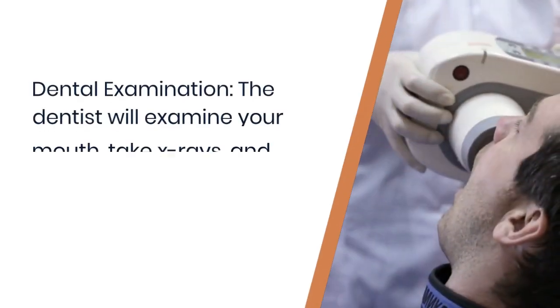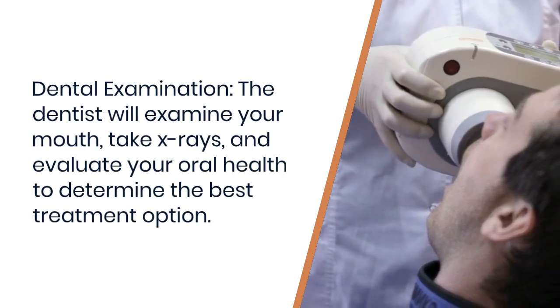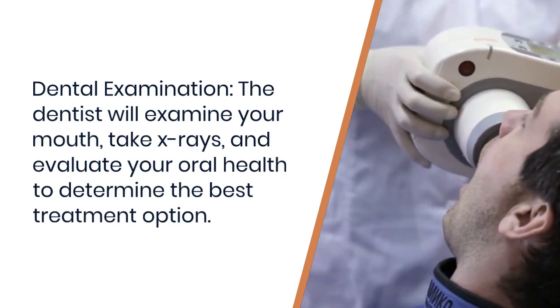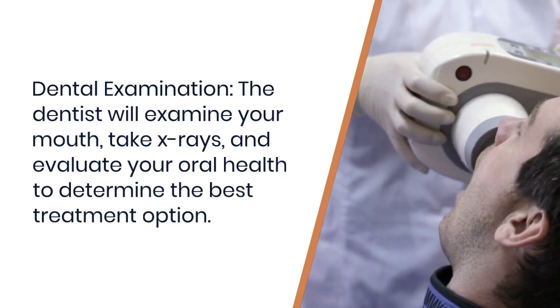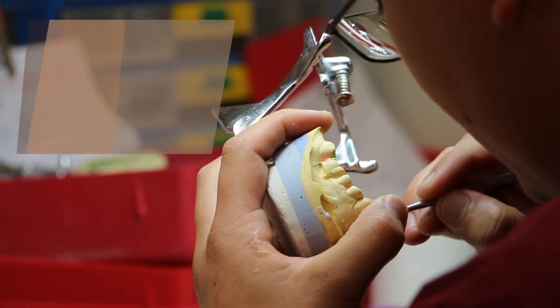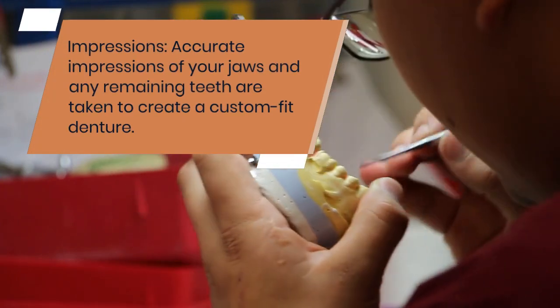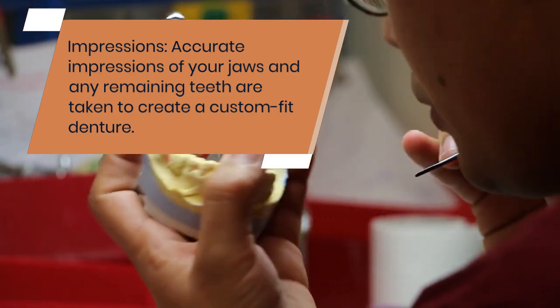The process of getting dentures typically involves several steps. Dental examination: the dentist will examine your mouth, take X-rays, and evaluate your oral health to determine the best treatment option. Impressions: accurate impressions of your jaws and any remaining teeth are taken to create a custom-fit denture.